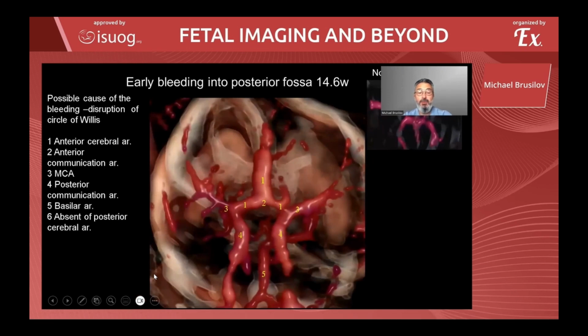During examination of the circle of Willis, we can see here a possible cause of the bleeding, disruption of the circle of Willis.